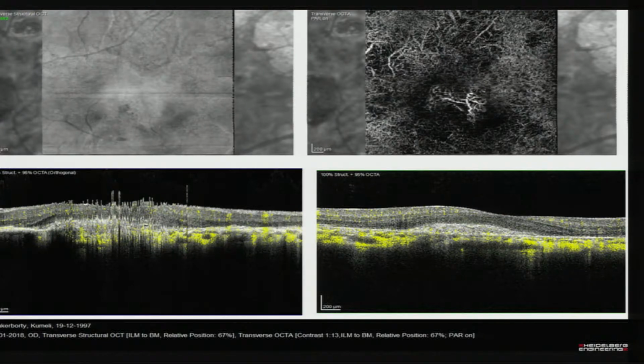Just want to understand how a subscar net causes metamorphopsia. How? The scar is underneath the retinal layers, and there is no fluid in your pictures. So how are the photoreceptors and all the metamorphopsia happening? Where is the fluid coming into the tissues, or we cannot see it?